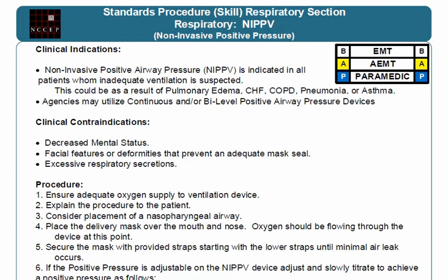Again, as the slideshow will go through briefly, CPAP is something that we want to continually train on and employ in the pre-hospital setting, and BiPAP will be something that we utilize more for interfacility transports, because it's more of a long-term management type of intervention, not to mention the fact that BiPAP devices are tremendously more expensive.